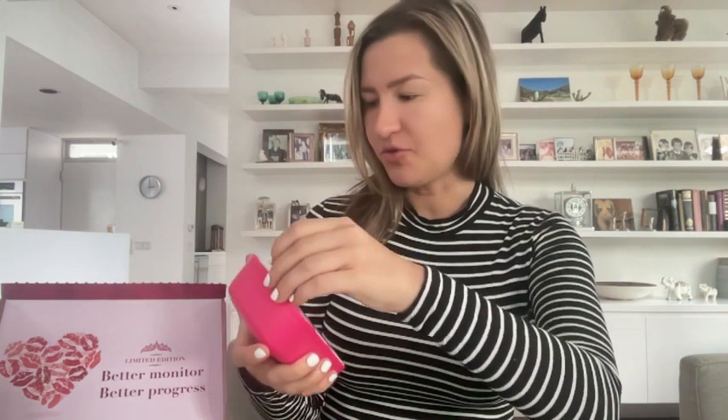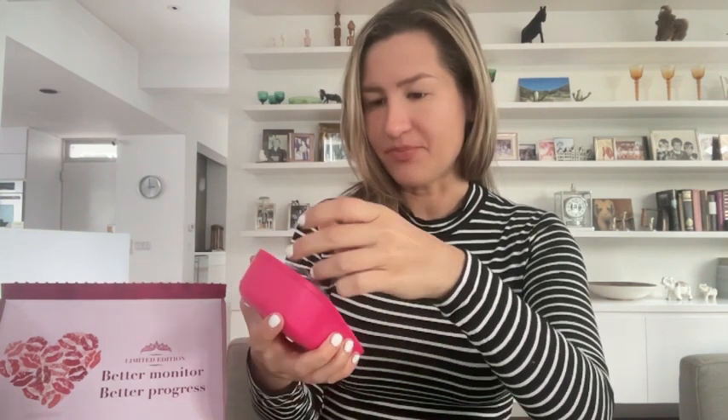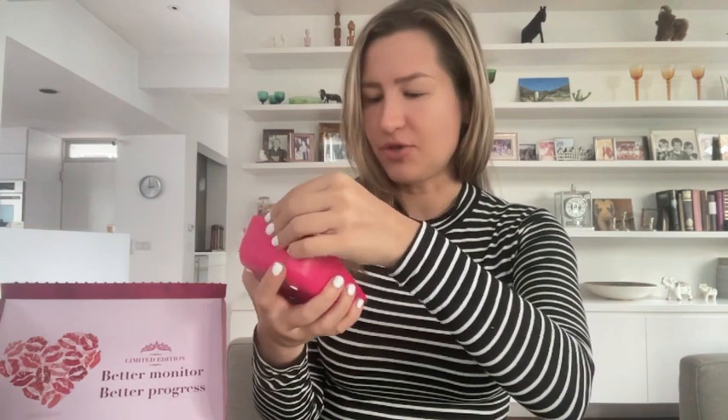Here is your blood pressure monitor on its own. You can set it up via the app — it gives you a QR code for easy access, which I'm definitely going to do later. There is also a USB cable so you can connect it to a laptop or any other device that supports the cable.